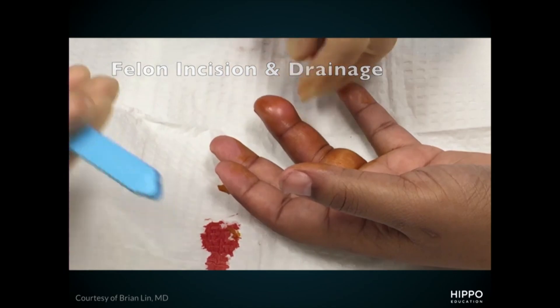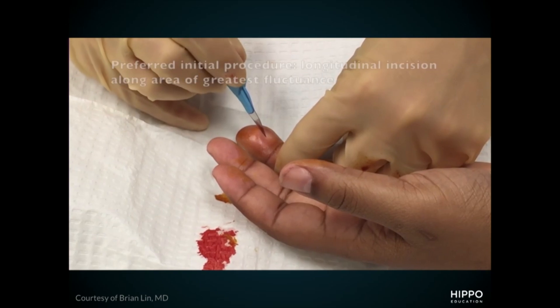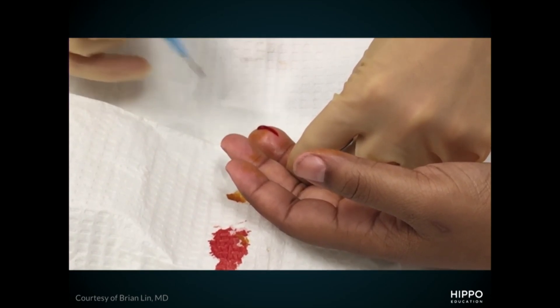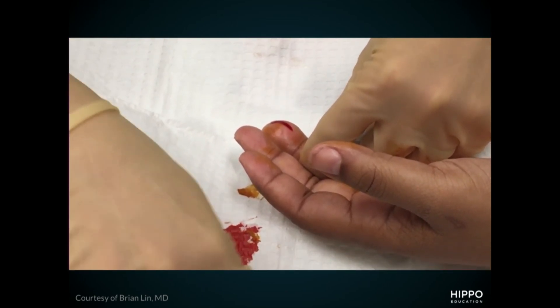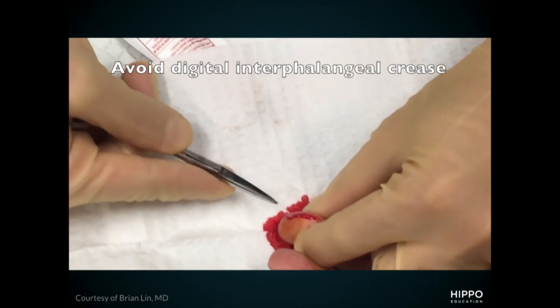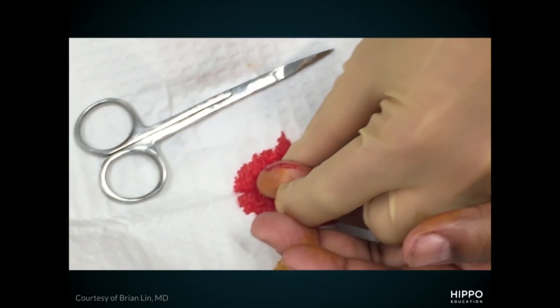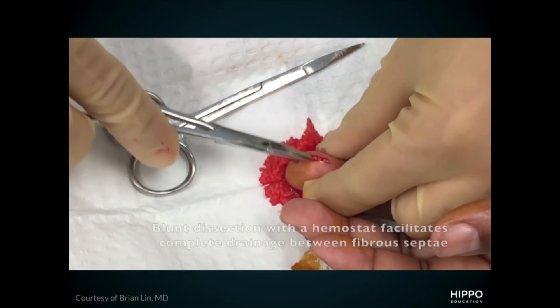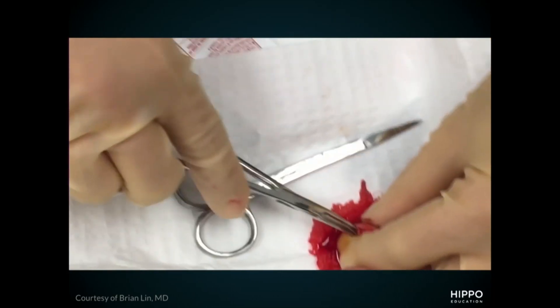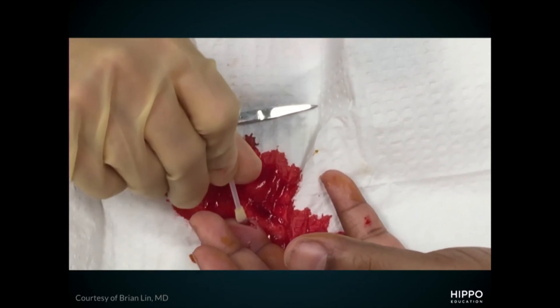You can see this patient has a pretty large felon at the tip — that area of fluctuance and swelling on the fingertip pad. They've already cleaned this patient up for aseptic technique and a digital nerve block. The incision starts as a volar longitudinal incision about five millimeters above the crease of the joint to avoid the flexor tendon. Because of these pockets of pus in the septae, you want to do blunt dissection to really open up those pockets and all those little compartments of pus. Here they're doing blunt dissection with hemostats — you can also use small scissors, being aware of the distal nerve and artery.